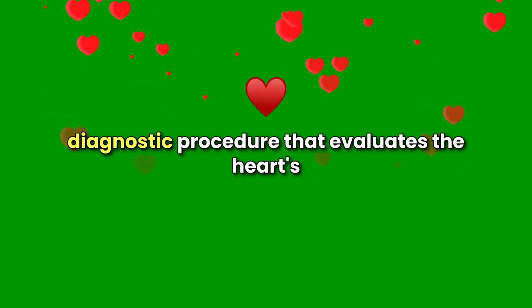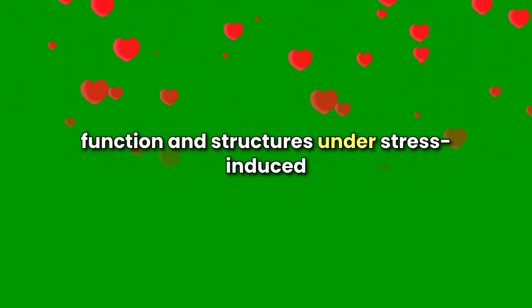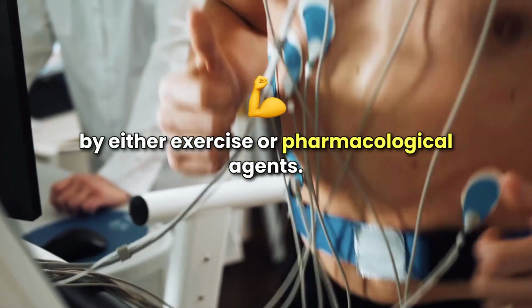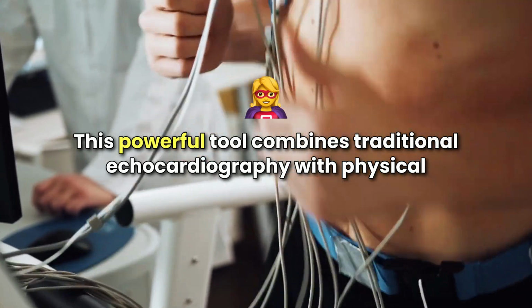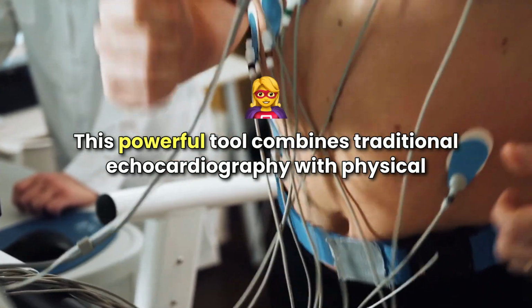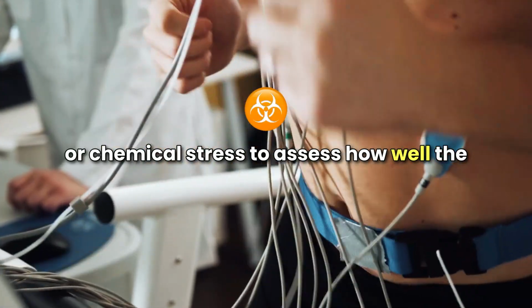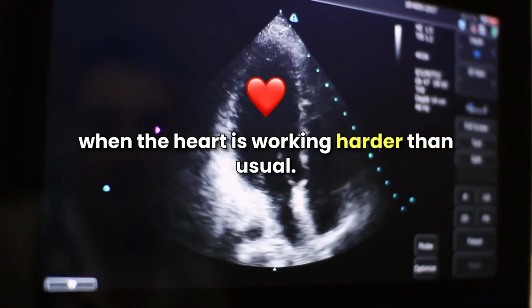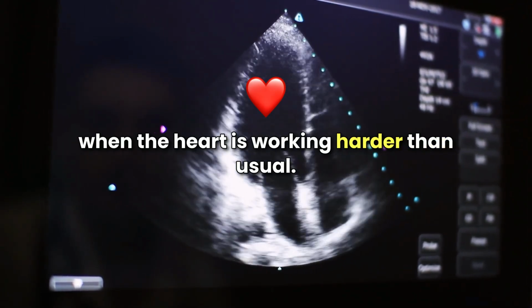Stress echocardiography is a non-invasive diagnostic procedure that evaluates the heart's function and structures under stress, induced by either exercise or pharmacological agents. This powerful tool combines traditional echocardiography with physical or chemical stress to assess how well the heart pumps blood and how its structures function when the heart is working harder than usual.